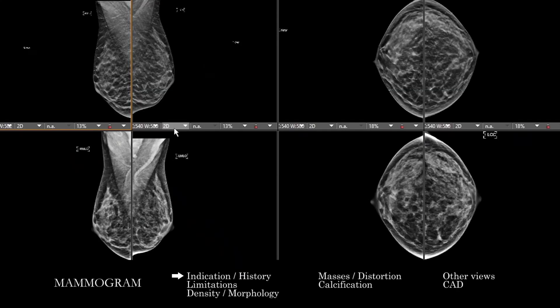Each place you may practice may have different hanging protocols and PACS. In our particular workspace, by convention, the current study is provided initially at the bottom and the prior study is at the top — MLO and CC views. I'll go through the different views and talk about the approach on specific views and image sets.